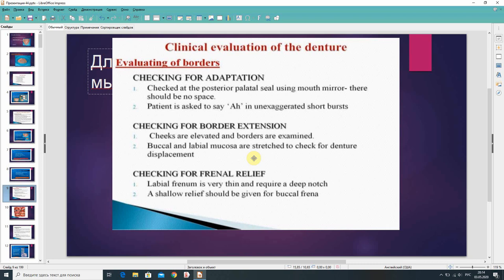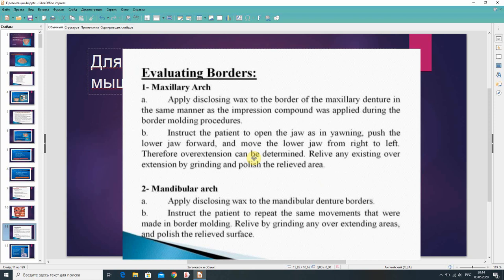Cheeks are elevated and borders are examined. Buccal and labial mucosa are stretched to check for denture displacement, and checking for frenal relief is performed. The labial frenum is very thin and requires a deep notch; a shallow relief should be given for the buccal frenum. For evaluating borders of the maxillary arch, apply a disclosing wax to the border of the maxillary denture in the same manner as the impression compound was applied during the border molding procedures. Instruct the patient to open the jaw as in yawning, push the lower jaw forward, and move the lower jaw from right to left.